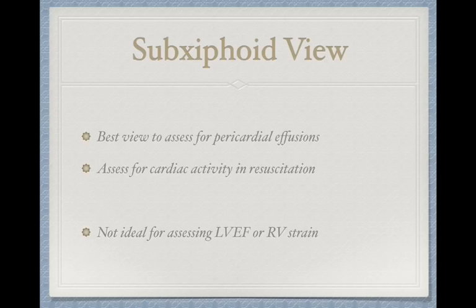Again, a little more advanced application of the subxiphoid view, but a nice thing to learn how to do. So not ideal for assessing for LV function or RV strain, but it can be done. I mean, the subxiphoid sometimes is your only window that you'll have, so you can almost do a complete echo exam off that subxiphoid view.